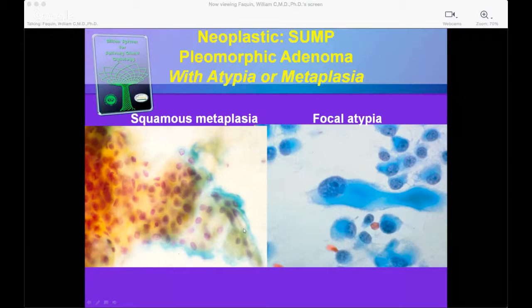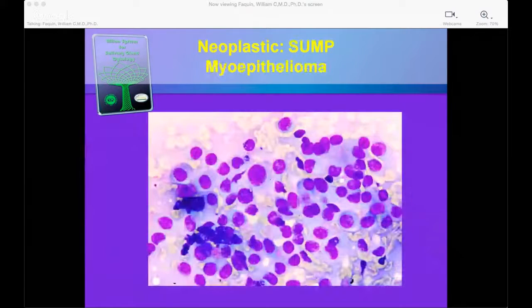This is squamous metaplasia. If you've seen enough pleomorphic adenomas with metaplastic changes, you may say, okay, it's probably a pleomorphic adenoma with metaplastic changes, but these look epidermoid. Am I sure it's not a mucoepidermoid carcinoma? On this side, it looks like it's probably a myoepithelial-rich pleomorphic adenoma, but I'm just not sure. This is a bizarre tumor cell here. Can I be certain that it's not some kind of malignancy? So both of these examples would be placed into this uncertain malignant potential category.